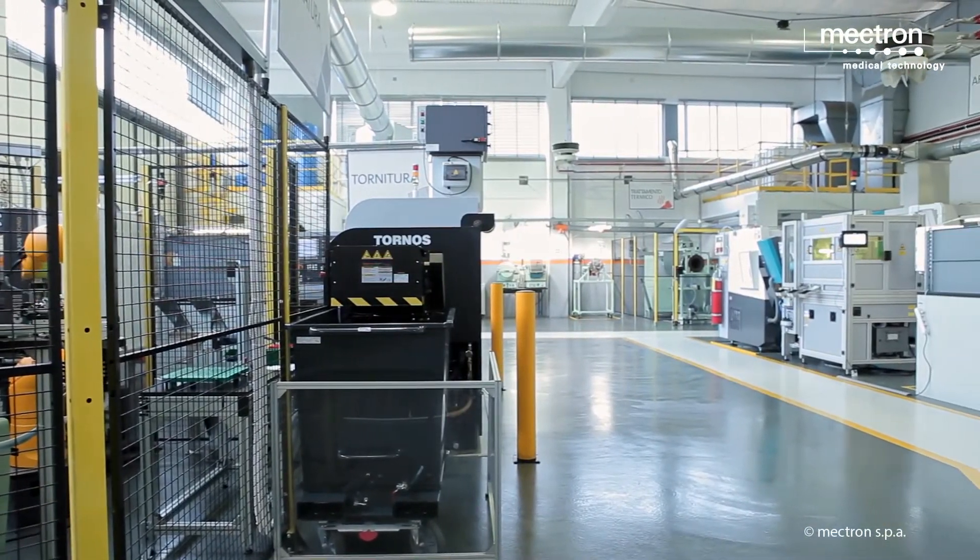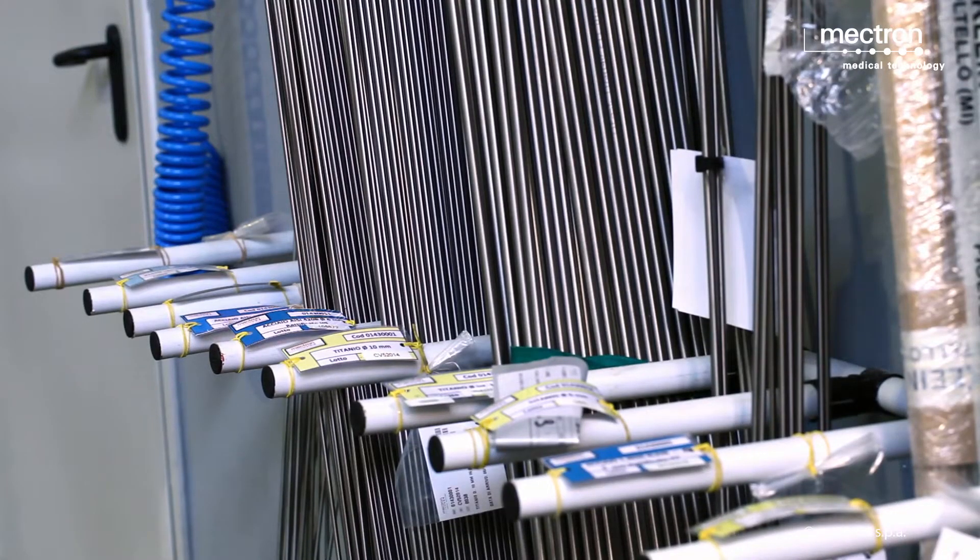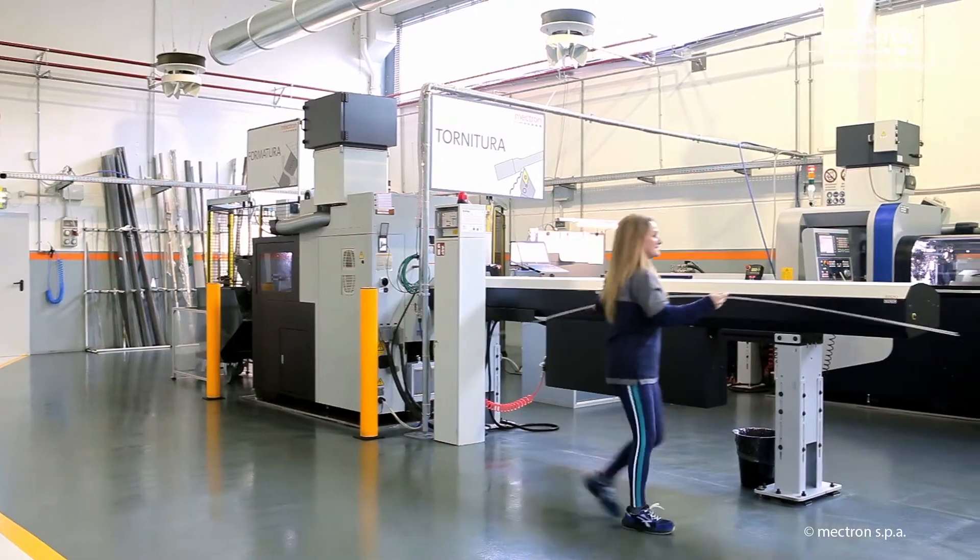Let us now have a close look at the manufacturing process. The material used for surgical inserts is medical grade stainless steel supplied in extruded bars.